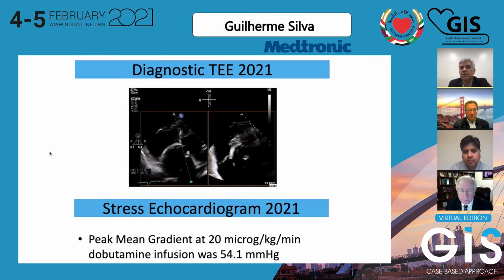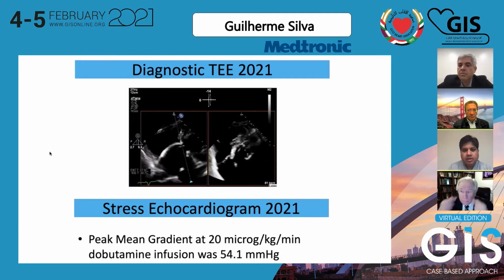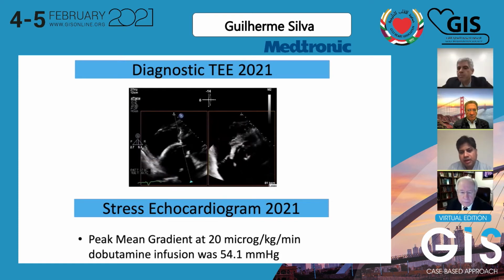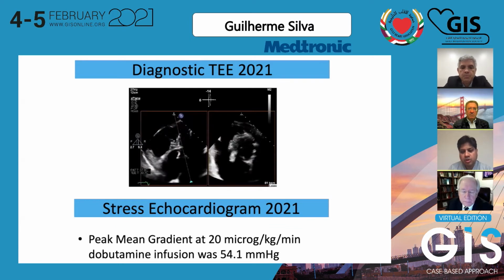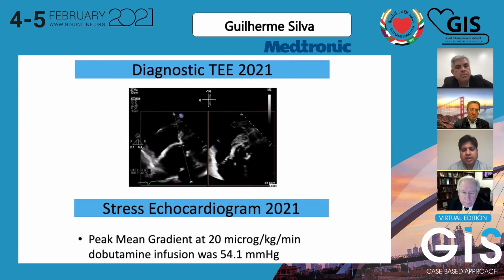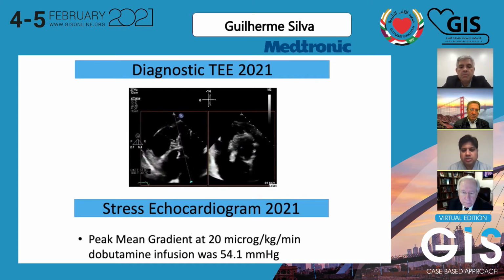Go ahead, Dr. Conero. So the interesting thing in this patient is you can see his annulus is quite big, and they chose a smaller valve. You can see the annulus area is close to 620. One would choose a valve close to a 29. But again, the valve chosen was smaller, a 23 valve.